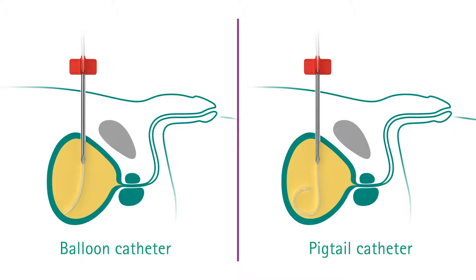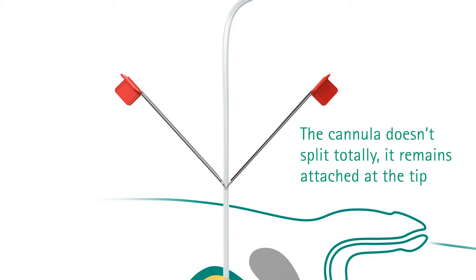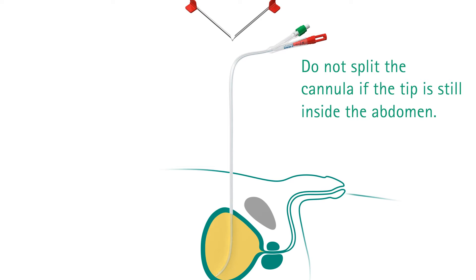The puncture cannula is retracted from the puncture channel. Once the cannula is completely out of the body, split the cannula by pulling on the wings. The cannula remains attached by the bevel tip. Do not split the cannula if the tip is still inside the abdomen.